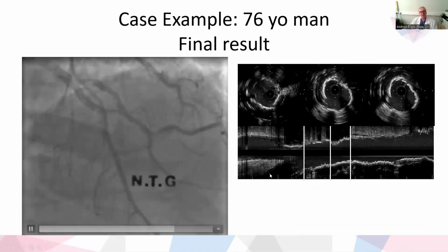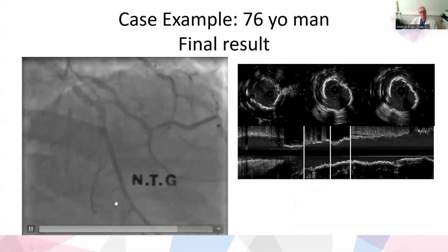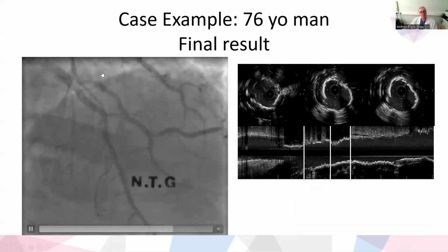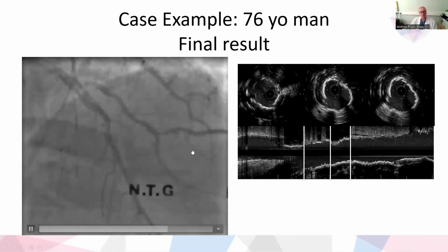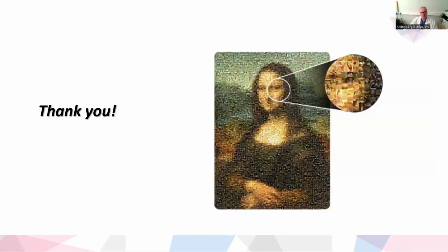This is the final touch and final imaging after this complex lesion treatment, and as you see, the result is very good. And after 3-5 years, the patient was still alive, and there were no complications.